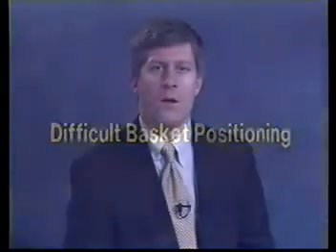The basket can be difficult to position around a tortuous curve. What techniques can be used to overcome this problem? Because the current version of the PTD does not go over a wire, occasionally one may find difficulty in passing the device around very tortuous grafts or through grafts with large pseudoaneurysms. When this occurs, I have found it helpful to use a hemostat or other device to alter the shape of the graft slightly, which usually allows the PTD to pass without difficulty.